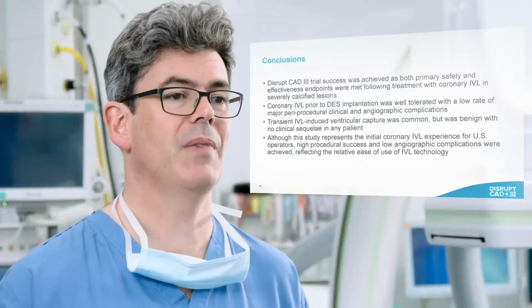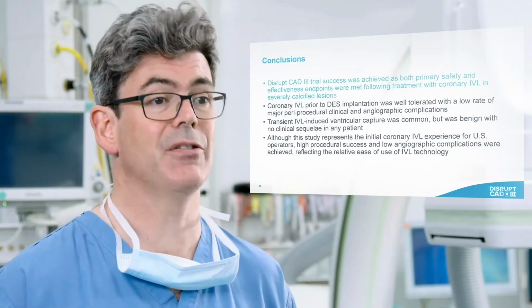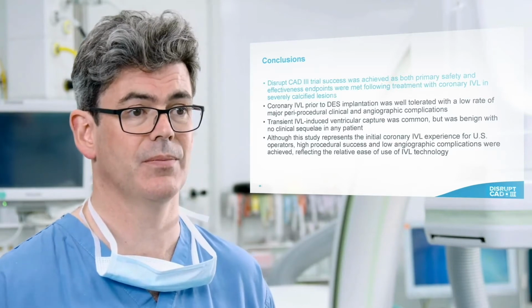In conclusion, I'd say that the success of the DISRUPT CAD III trial was achieved, as both the primary safety and effectiveness endpoints were met following treatment with coronary IVL in severely calcified lesions.